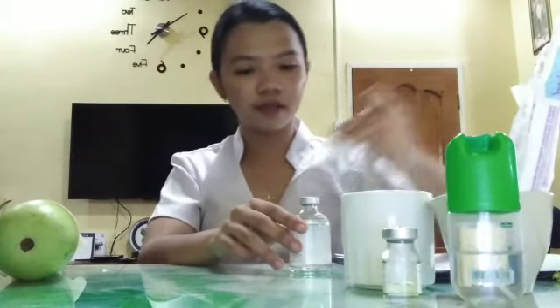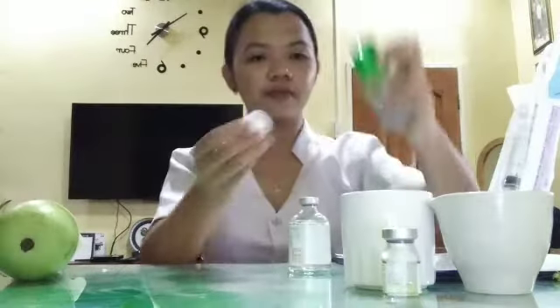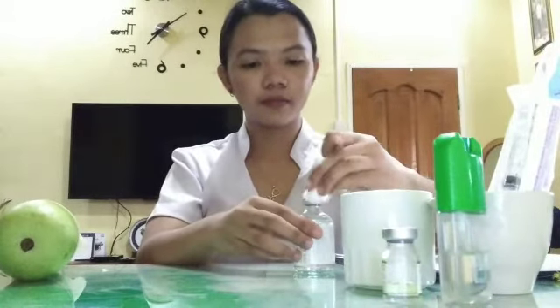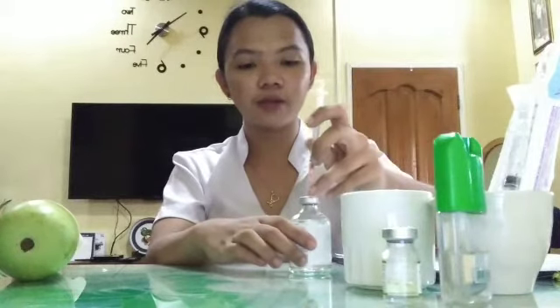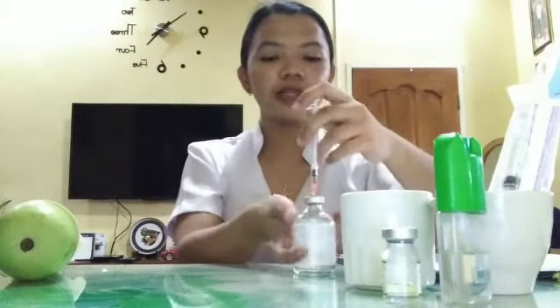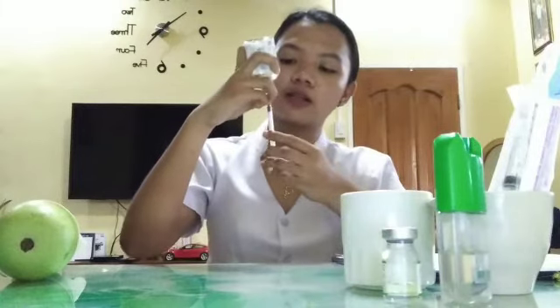Sorry, I've touched it, so we will let it dry. Assuming that it is already dry, we will put the syringe in and withdraw the exact dosage.